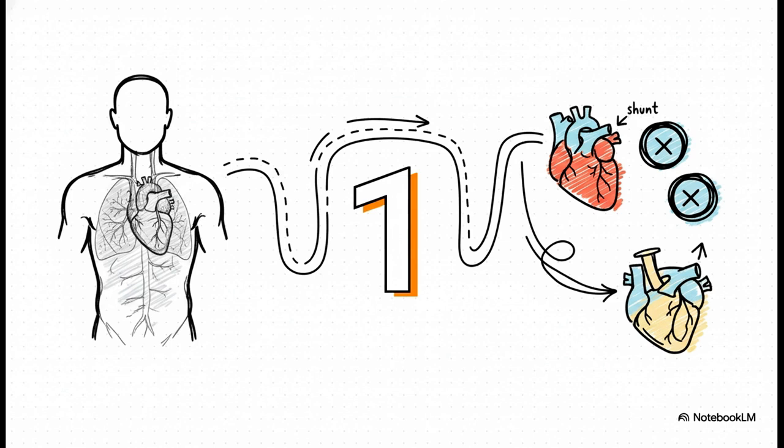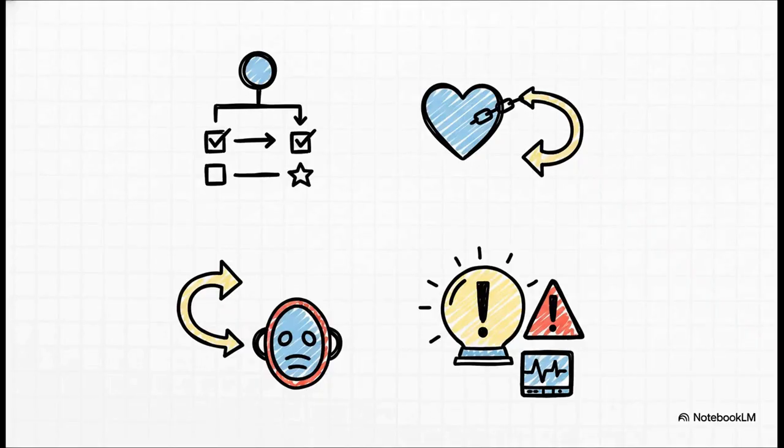Situs is your North Star. Before you even think about a valve, before you glance at a gradient, before you consider function, you find the situs. It is the fundamental anatomical roadmap that gives context and meaning to every other single finding in that report. And here are your 4 key action items.